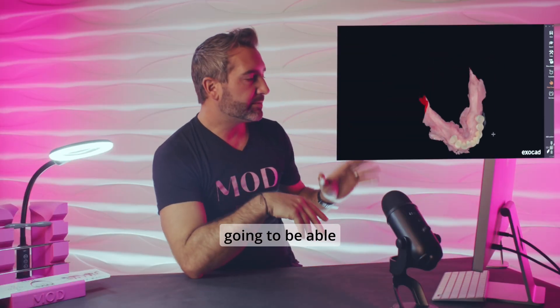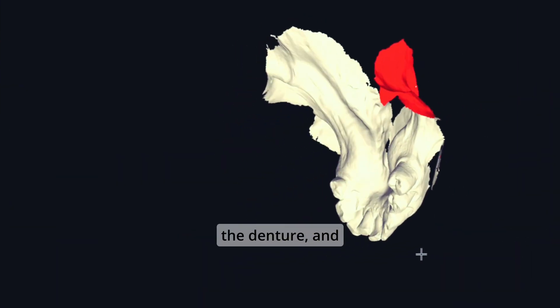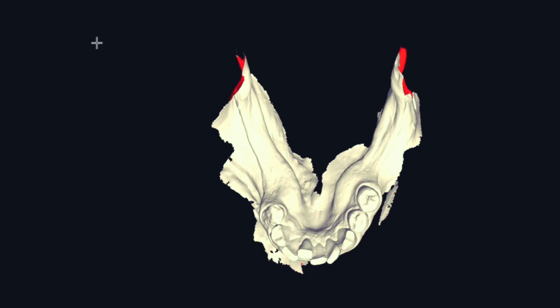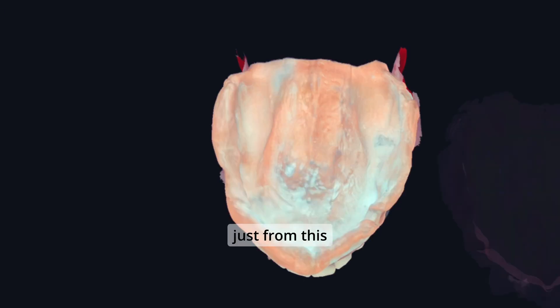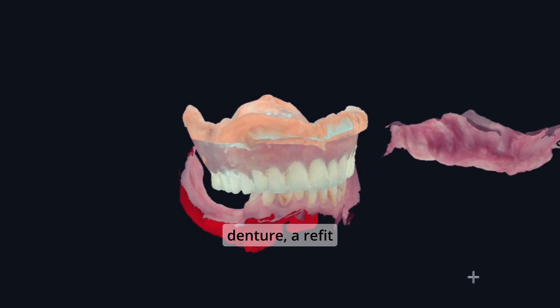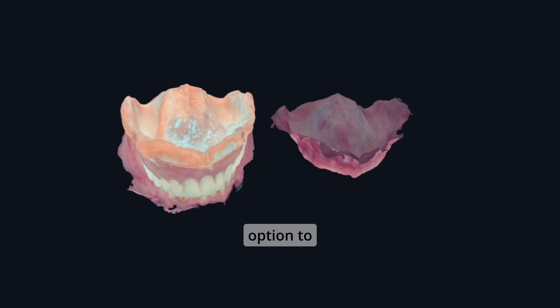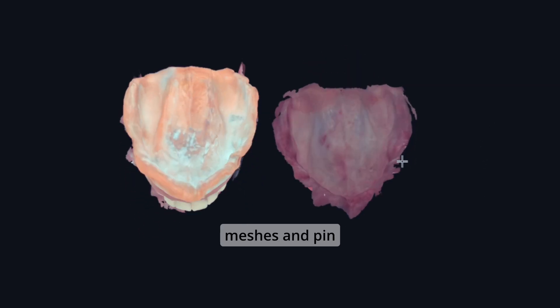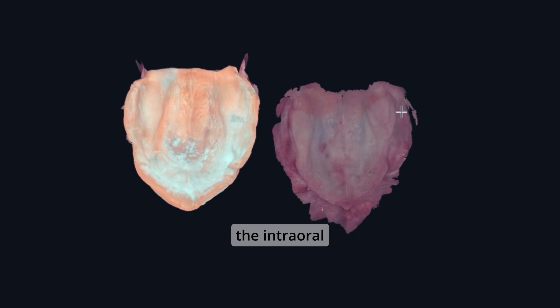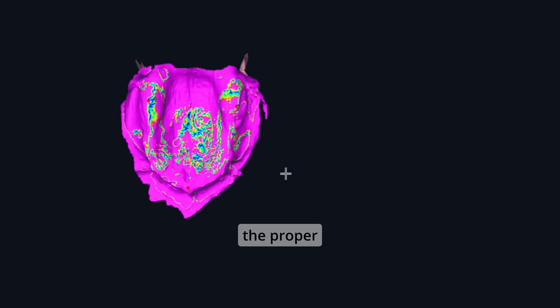Now in ExoCAD, we're going to bring in the lower arch and the denture, and those are going to be in occlusion. You could design a denture just from this information alone and do a brand new denture, a copy denture, or a refit copy denture. Or you have the option to go into expert mode, go to align meshes, and pin the intraoral maxillary scan of the soft tissues to the denture reline impression to get your vertical at the proper vertical.